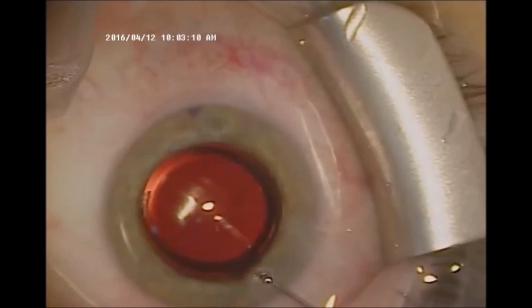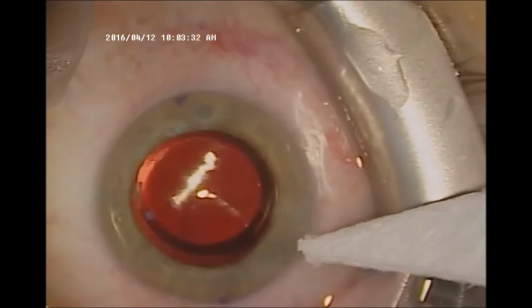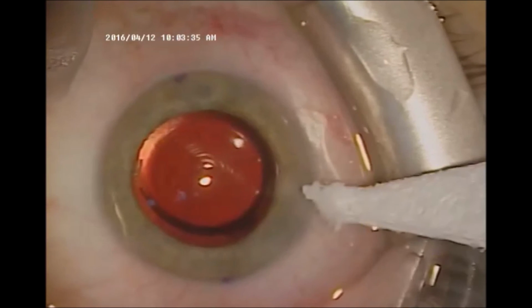I then hydrate the wounds, and they are self-sealing, and check the eye to make sure that the wounds are watertight.